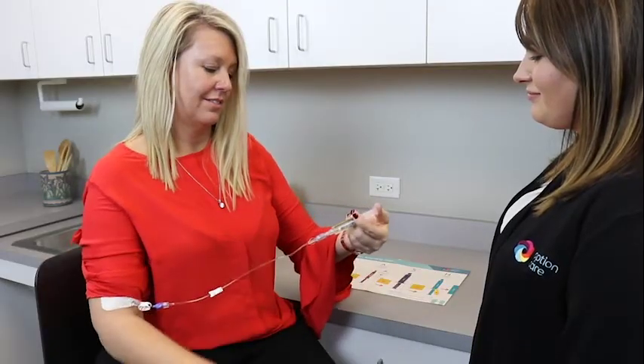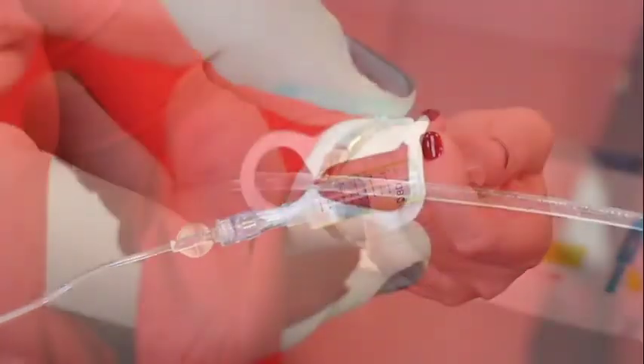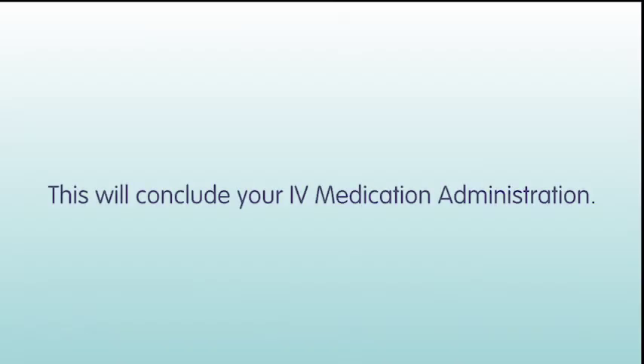Flush your IV catheter using a push-pause method. Close the clamp on your IV catheter and/or extension set if indicated. Lastly, remove and discard the heparin flush syringe in a trash container. That concludes your IV medication administration.